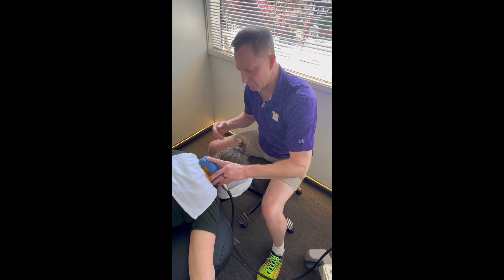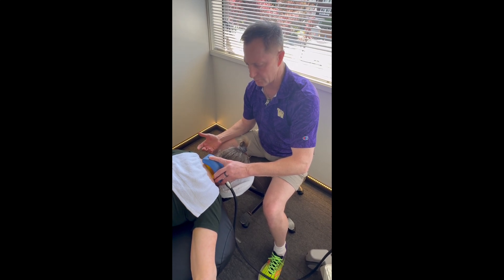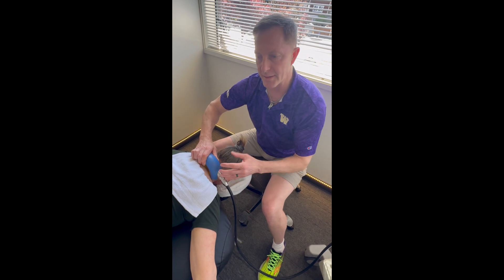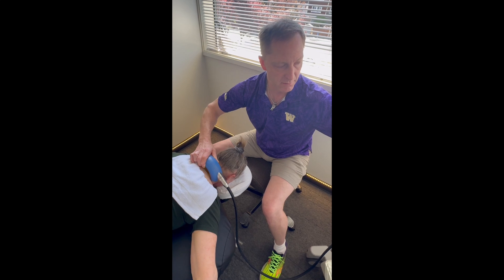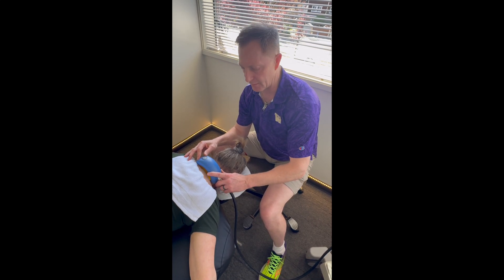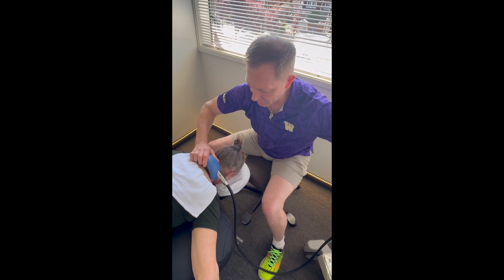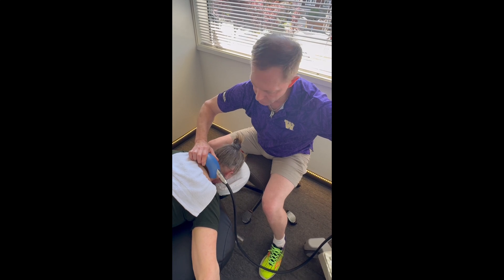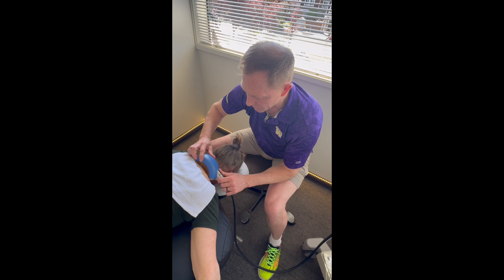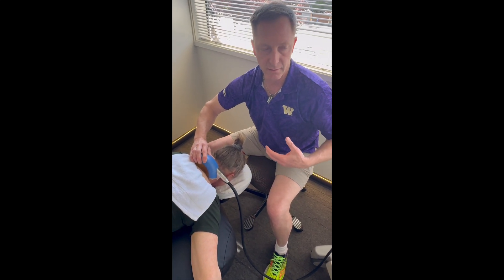I can raise the number of times it fires up to eight times per second. My patient still doesn't feel anything. So I'm going to increase the intensity. Part of it is going slow enough and letting the pressure and energy build up on the tissue. She feels just a little poking — not achy yet, just some poking. I have to let the energy build up on the tissue, then give her a couple more pulses.